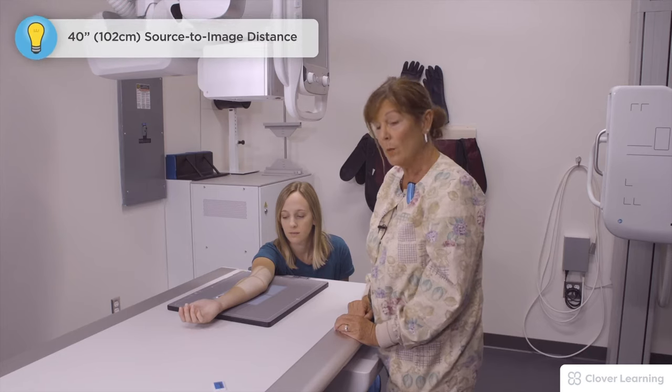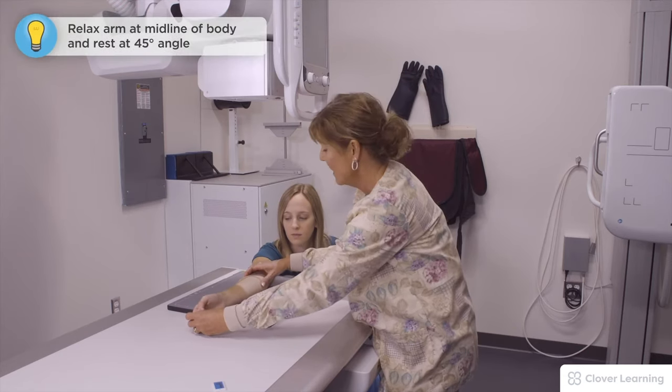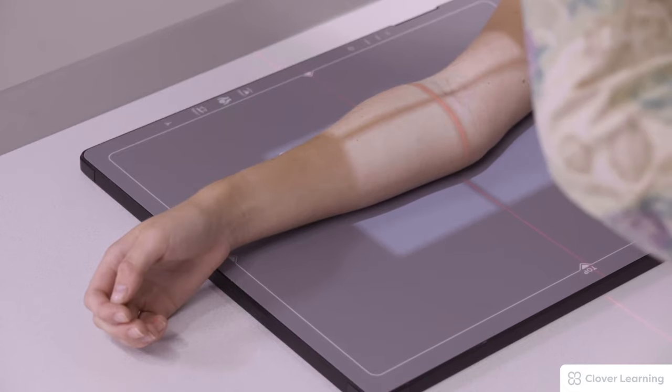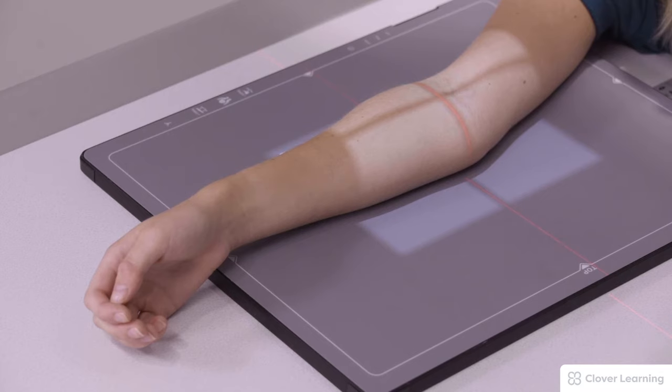For the medial oblique, we're going to let her arm just kind of relax towards the midline of the body, and it's kind of at a 45-degree angle. We're still centered at the elbow joint. Our collimation remains the same, and on this particular view, we will see the coronoid.